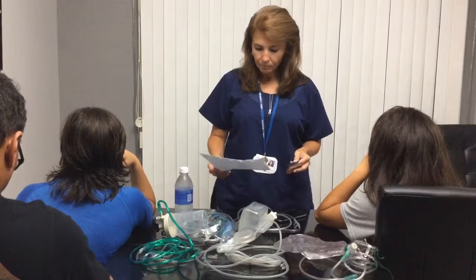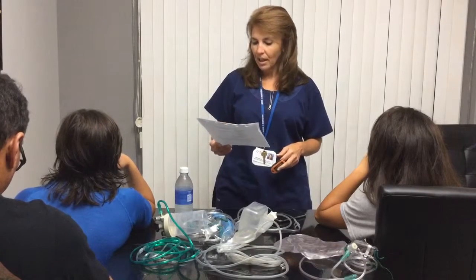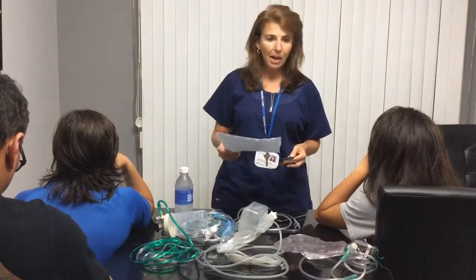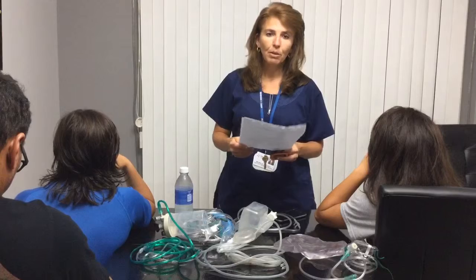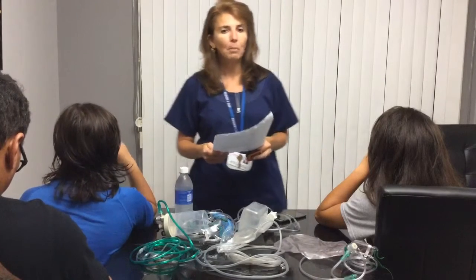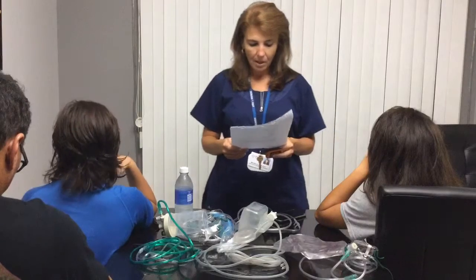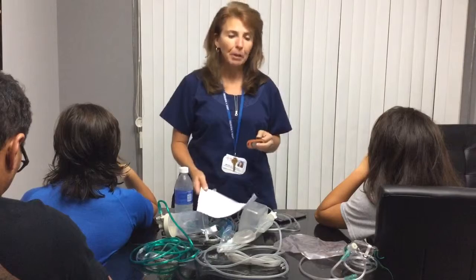Pulse oximetry is indicated for monitoring of oxygenation and can provide early warning signs for hypoxemia. I'll be citing an abstract from Gibran in a Critical Care magazine from 2015, as well as the hospital-wide and respiratory care policies and procedures for this presentation. Correct application of pulse oximetry is very important.